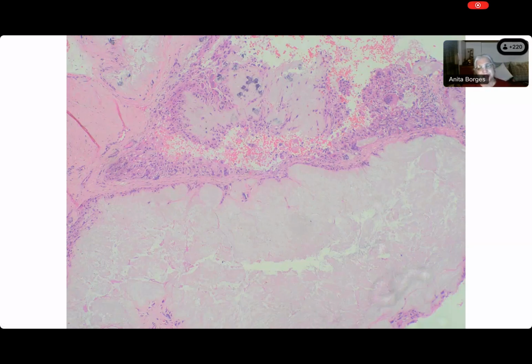It is used in some situations where you get this extracellular deposition, and that word is floccule. Have you ever used the word floccule, Mansi? Okay. No, floccule is a fluffy kind of loose deposit. So you can see that this is not tight. This is not like hyalinized collagen, which is almost like a sheet that has no folds in it. Here you can make out a kind of fluffy deposition. Let me get my pointer. See the fluffiness of all of these areas. It is not a thick sheet, because in between you have areas where there is no deposition of any kind.